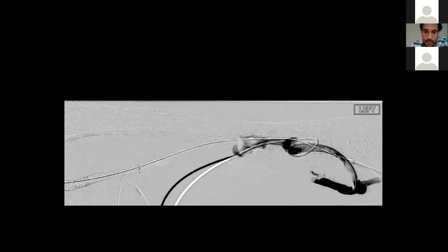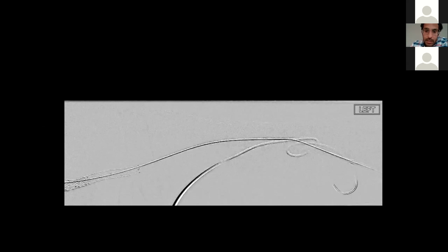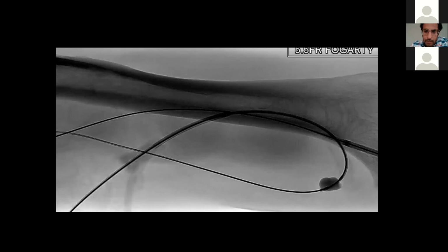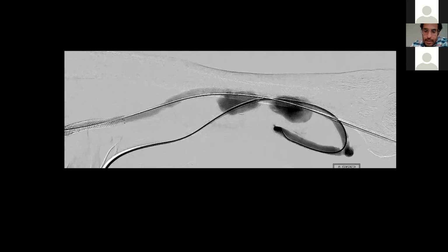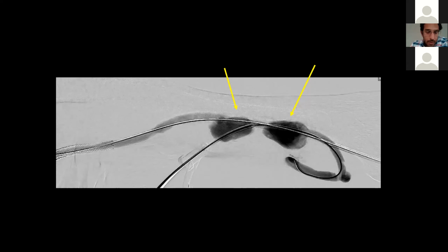And this was post declot. You can see that the flow is kind of ratty, and there's some additional clot, and it's specifically within the fistula. So again, pulled the plug again and did some additional cleaner, which I unfortunately don't have a picture of, but you can see how the aneurysms are now nice and clear. And again, an example of using it through stents, but also for aneurysms as well. It's pretty helpful.